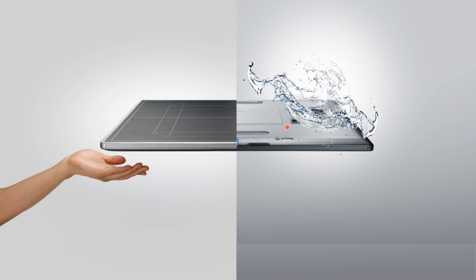You can store images on it. You can use it in memory mode. Say if there's a problem with the DR mobile machine, which we're going to go on to in a minute, when you go to do radiography elsewhere in the department, because you can take the machine with you, if there's a problem with the software on there, you can tell it to remember the X-rays and download them at a later date, which can hold up to 250 images. And it's a top-notch bit of kit, and it's tough for what it is.